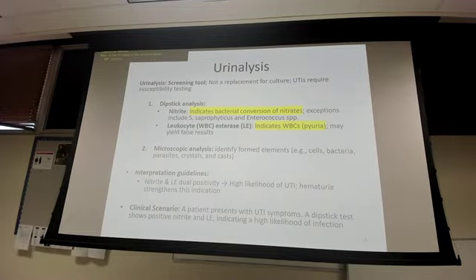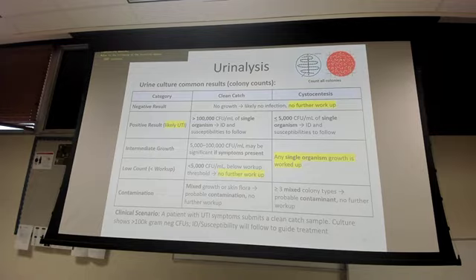All right, so dipstick analysis, we talked about this. Nitrites, you're looking for the bacteria that converts nitrates to nitrites, and then your leukocyte esterase is your white blood cells, right? An indication of some type of infection going on. Likelihood of a UTI or hematuria.